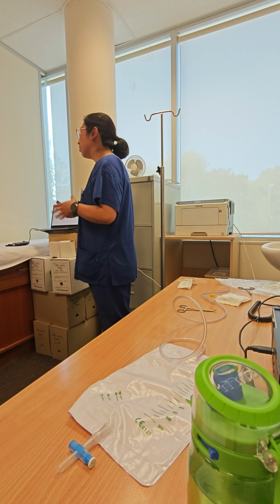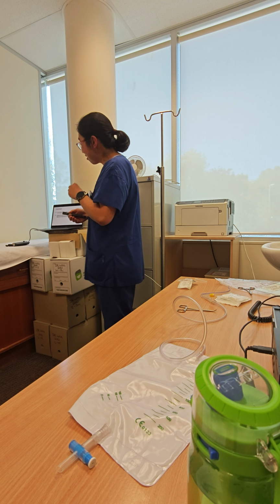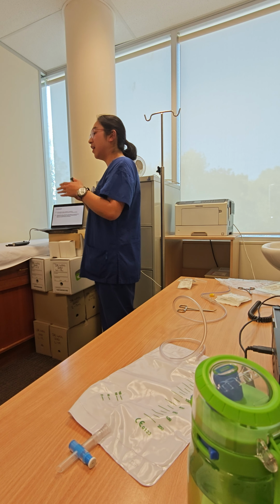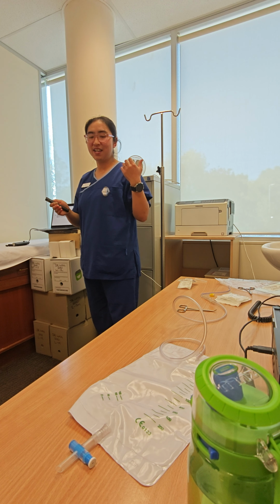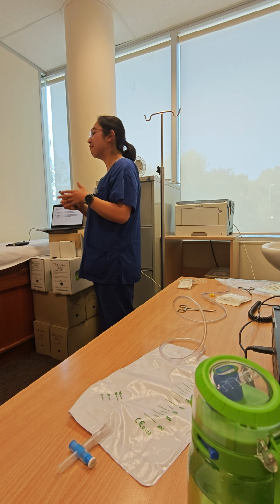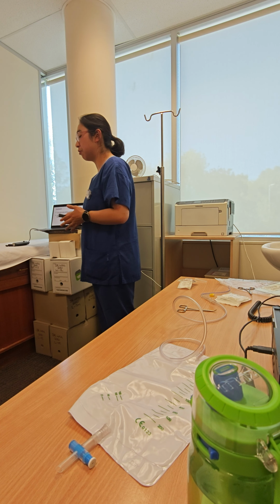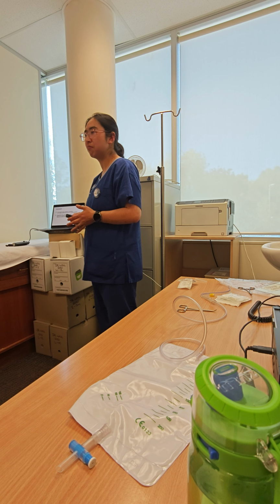So to conclude, we know that the post-prostate surgical cystogram is important to help a surgeon evaluate whether there is any leak in the bladder. It's a simple procedure, as I explained, but it's not an easy one. If you want to reach a very perfect result, you have to concentrate on all the details. You have to know how to work with people, how to work as a team.